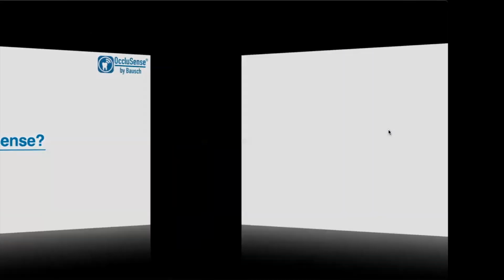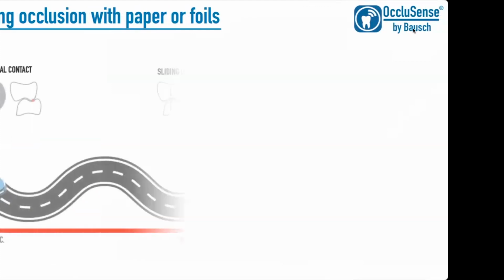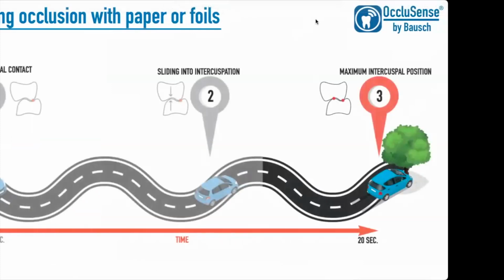Right, so do we need OccluSense if we have a well-working system to check occlusion on our patients already? To understand the process, I would like you to take a look at this pathway. So in order to get from an initial contact over to the maximum intercuspal position, you have a process that is happening. So from one initial contact via sliding over pathway 2 into the maximum intercuspal position on 3, you are actually going through a process over time.